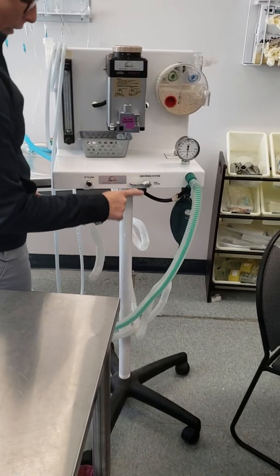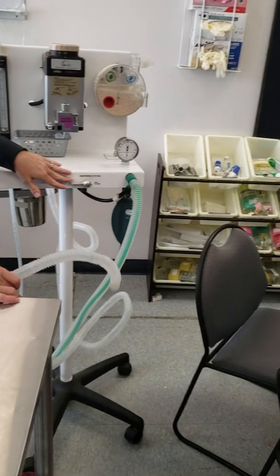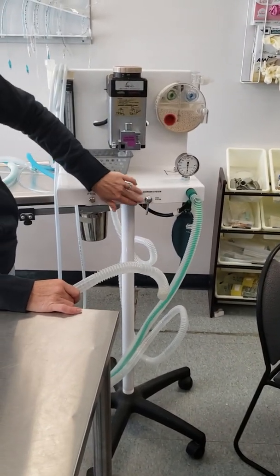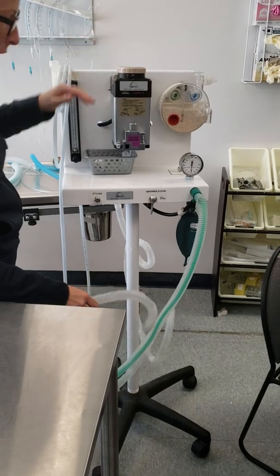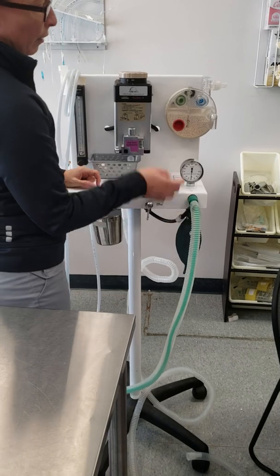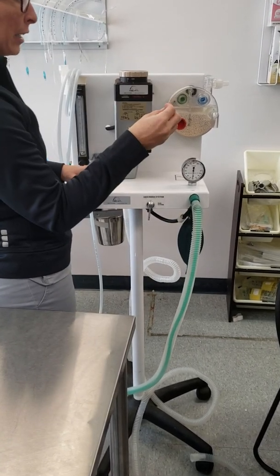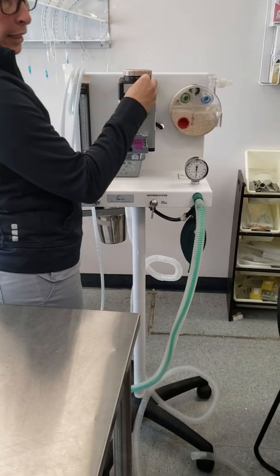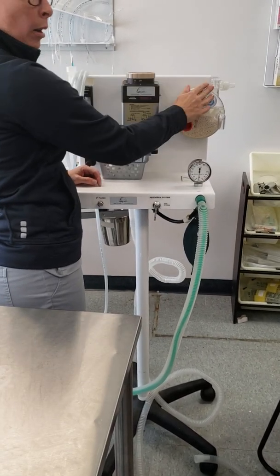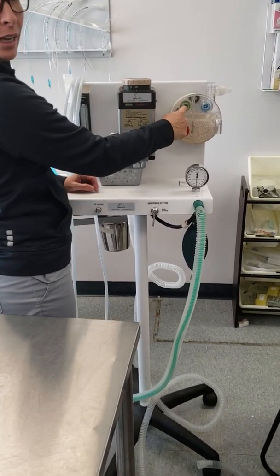Okay, so now if I'm going to be doing my absorber system or my rebreathing system, I need to switch it, okay, so that it's now directing my air up here. So I can figure out, I don't have a tube, but I can figure out the side that the fresh gas comes out of by knowing where the garbage air goes in. And if we remember that the garbage air always goes out where our pop-off and our bag and our scavenge hookup is, I know this is my fresh gas inlet.